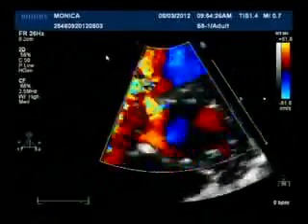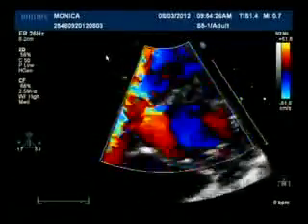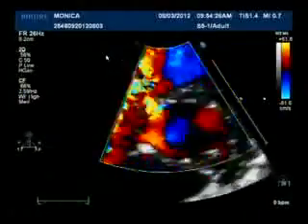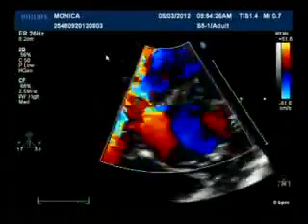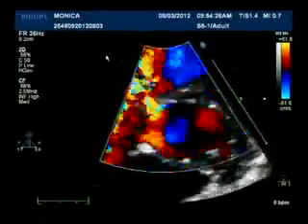And on the RV side, that is distal to the aneurysm? Yes, there is membranoseptal aneurysmal tissue. The jet is splitting into a VSD jet and an indirect LV to RA shunt. So you have a shunt to RA as well as a shunt to RV here.